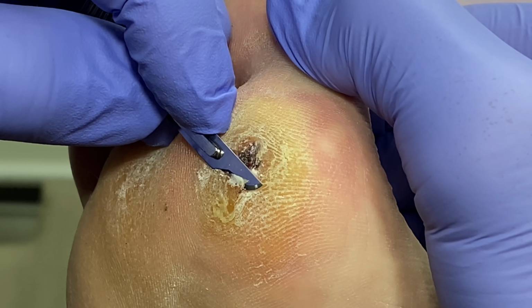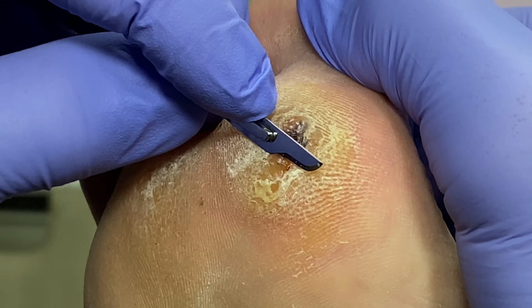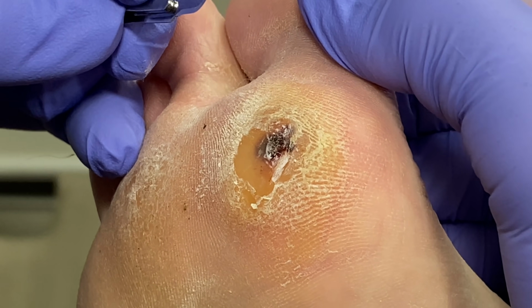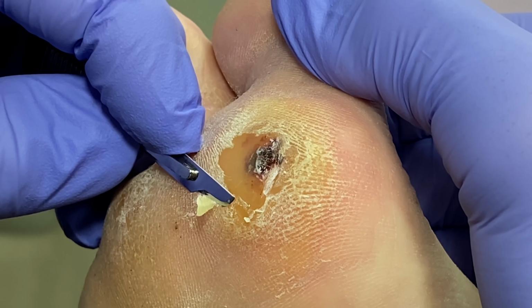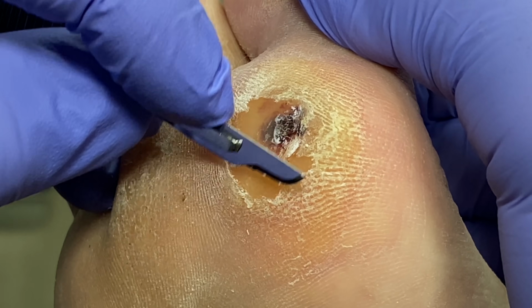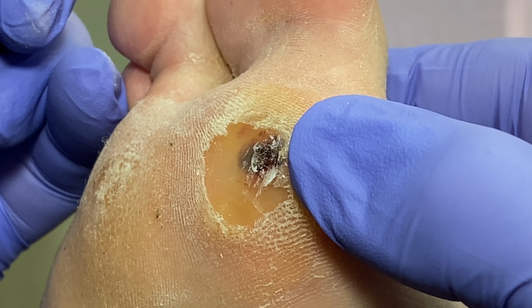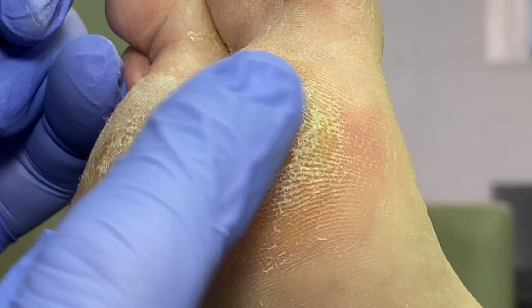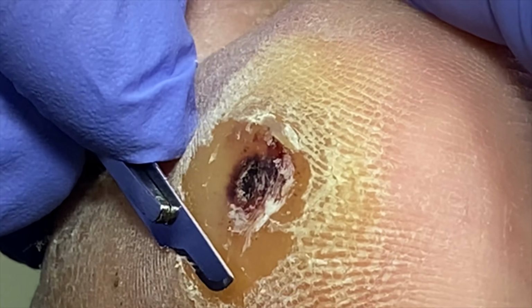A lot of these patients, as we all know, one of the side effects from diabetes is neuropathy, and the patient is nodding his head up and down. I've seen these. This is what we call a first metatarsal head callus, which can easily turn into an ulcer. Sub means underneath, right? So let's continue to dig further.